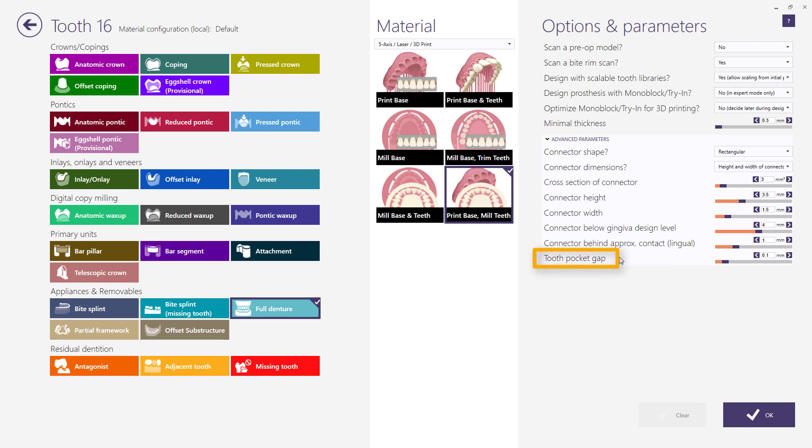Tooth pocket gap is another parameter which can affect the adaptation of denture base to the teeth.